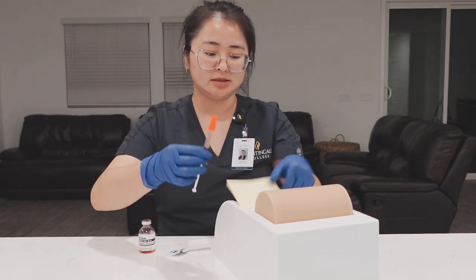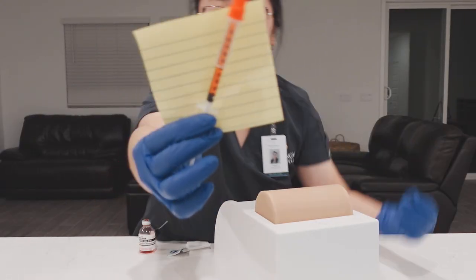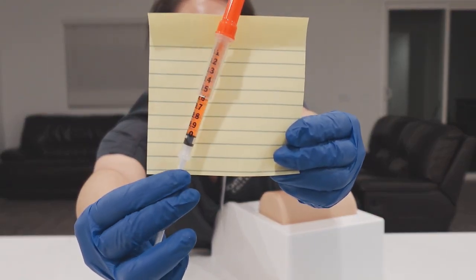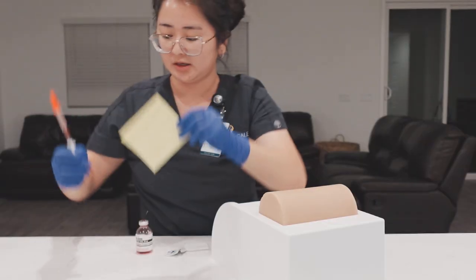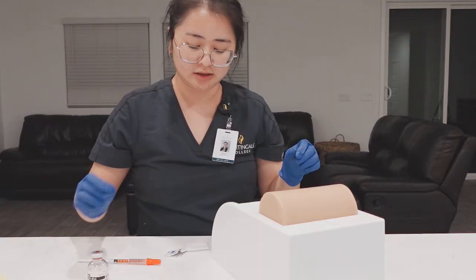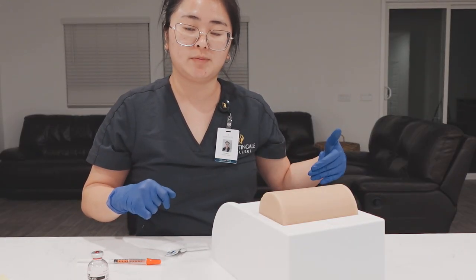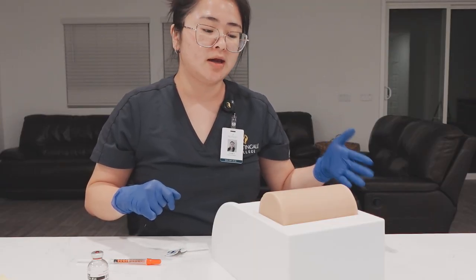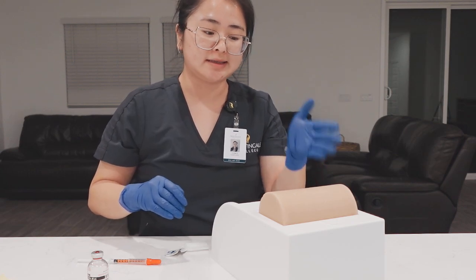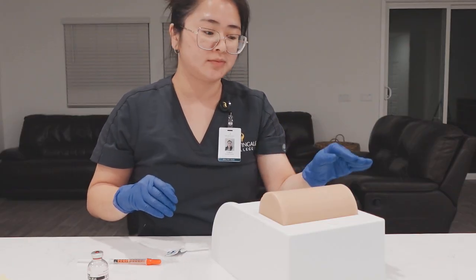So now that we've capped it, I am going to show you with this. Let me go over. Do you see it? Yes. Now, we're going to put this onto the side like so. We're going to move this medication, and there are 3 sites that we can use. We can use the back of the arm, the upper thigh, or the lower abdomen. Now for this patient, we're using the lower abdomen. And the injection site needs to be 5 centimeters or more from the umbilicus, left or right.